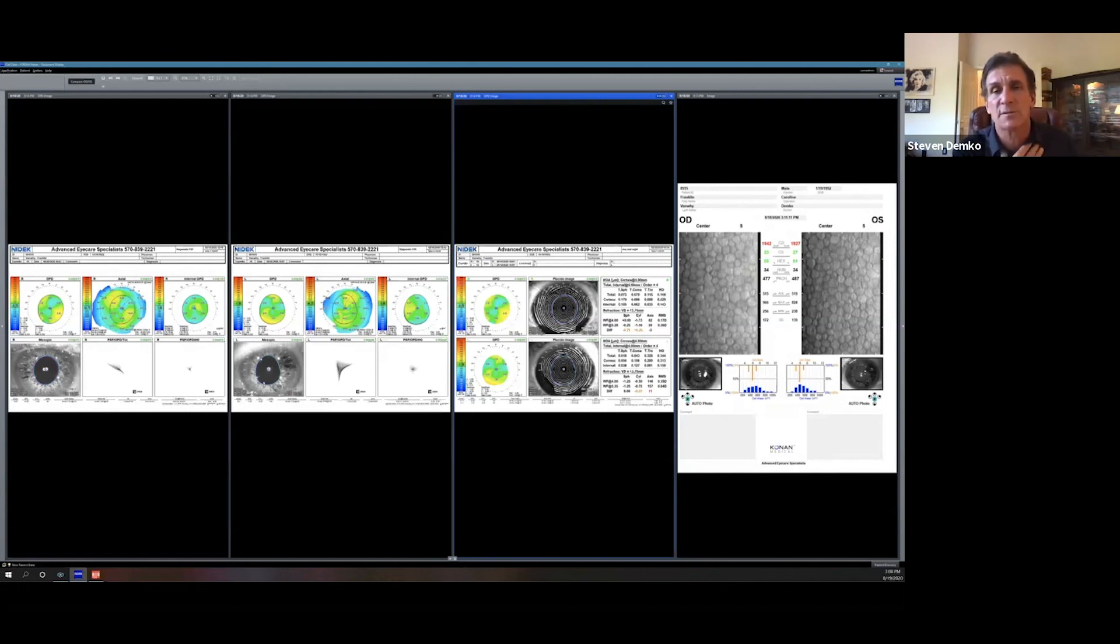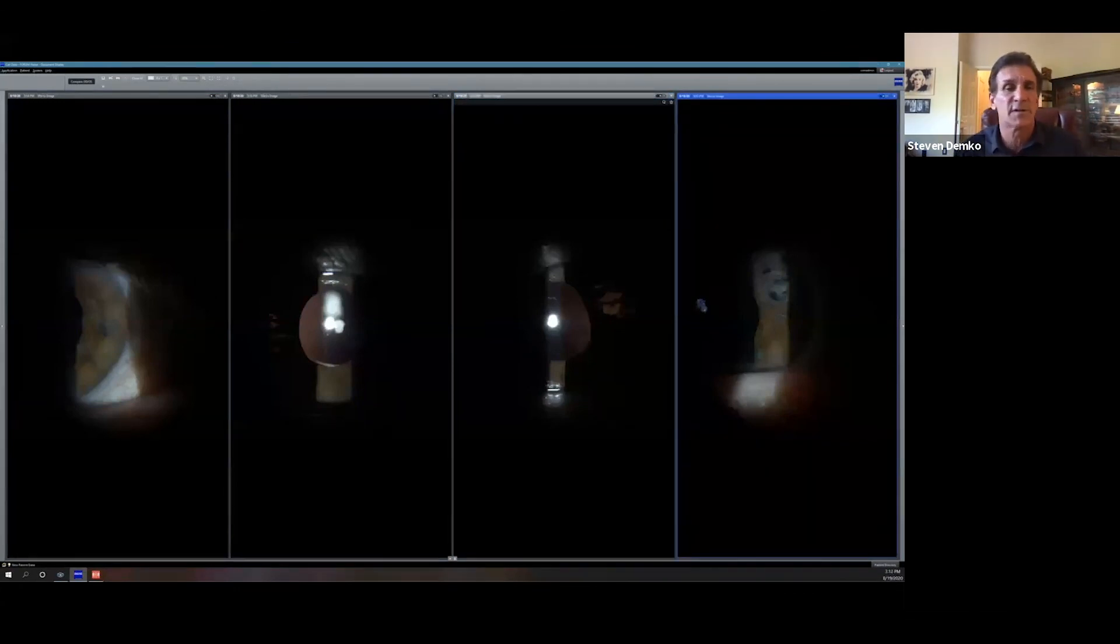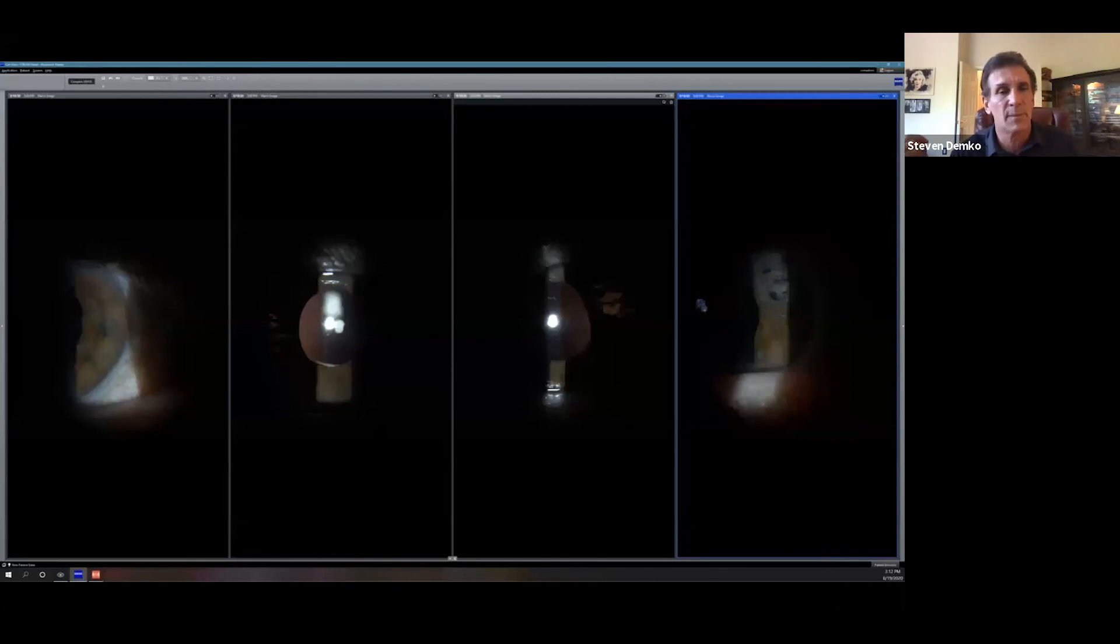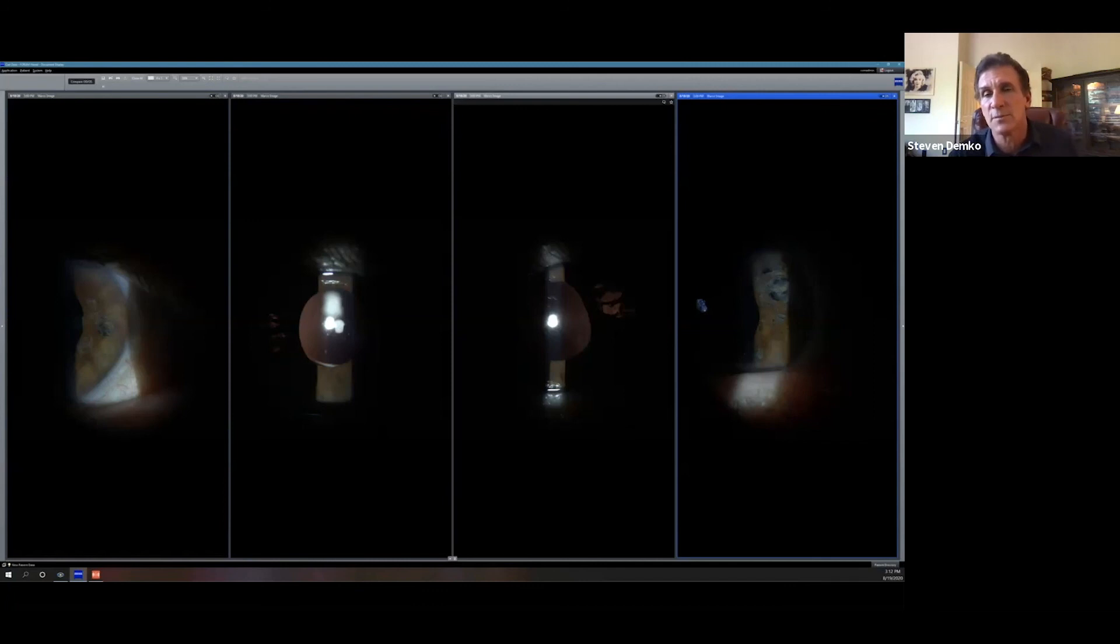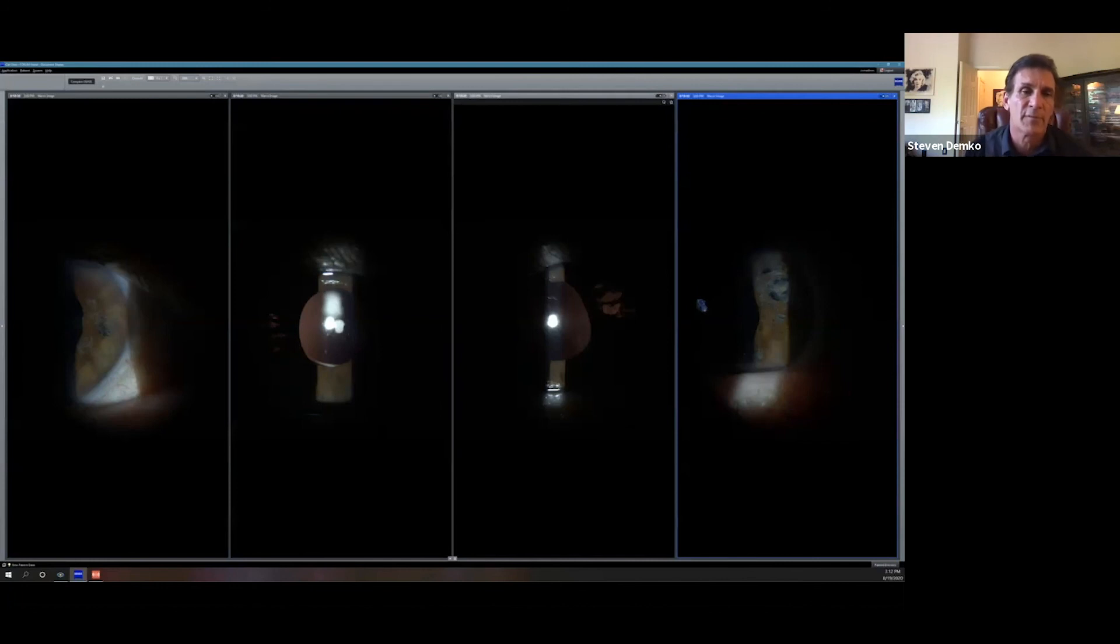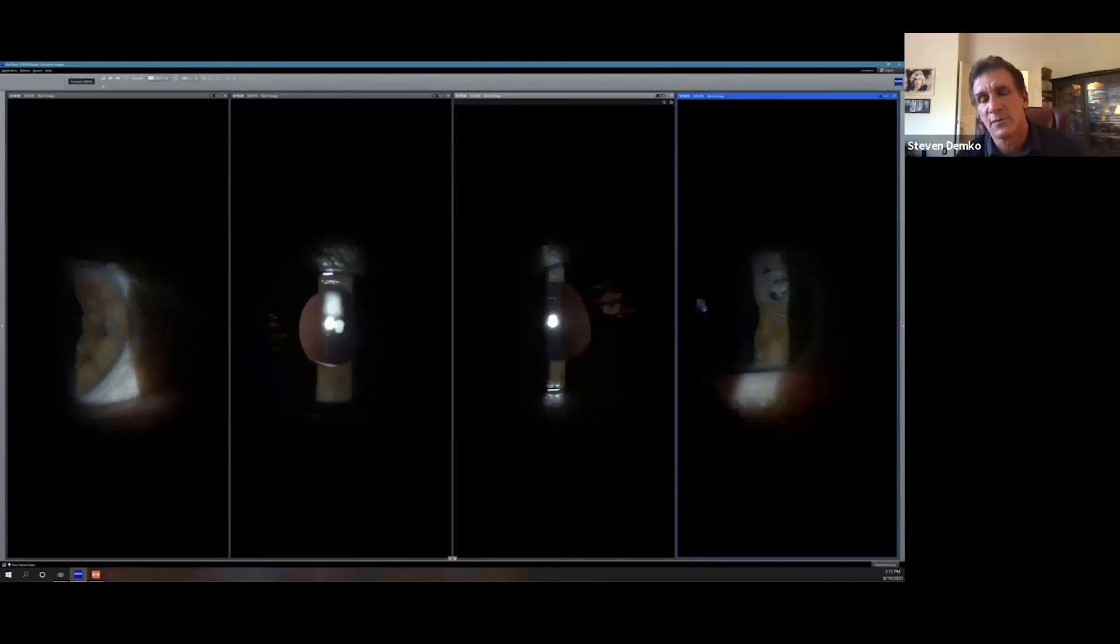So I do the refraction and I put some drops in the patient's eyes and I look inside. And what do I see? I see iris atrophy. So very quickly, I have an anterior segment camera at every slit lamp. I take some pictures of this to document it. And the patient's wondering why at night he's getting these weird sensations of glare. So I show him that he has what we would call iris transillumination. He has a problem with glare because of this. So here you can see I did retro on this, put the light through the pupil. It's shining back from the retina. And there you can see on the left, the iris atrophy. And then you can see the effects of the transillumination for the right eye and the left eye.